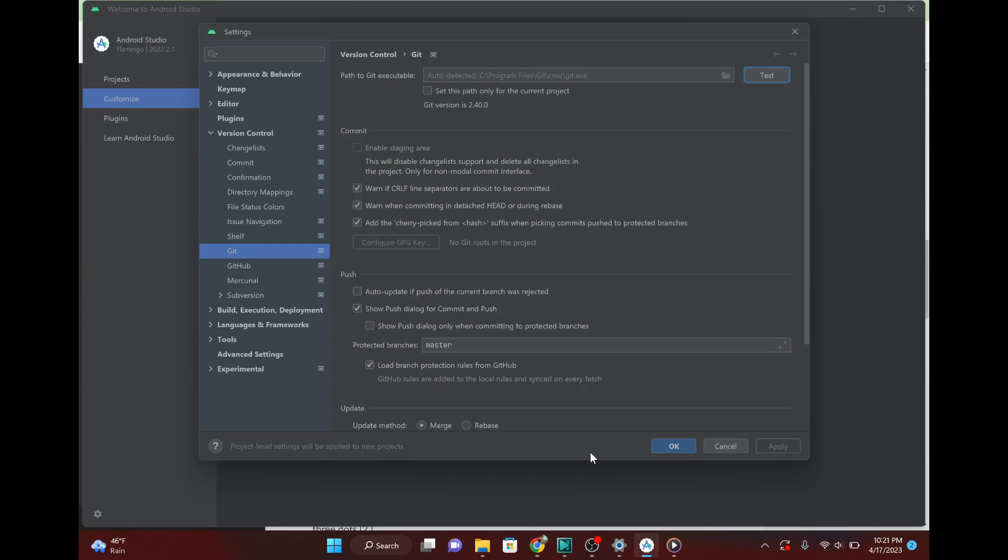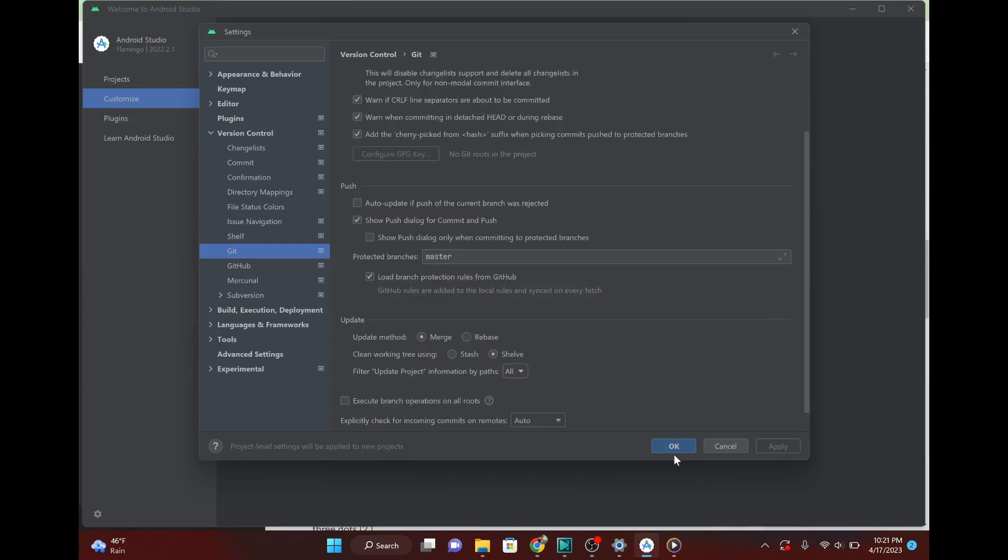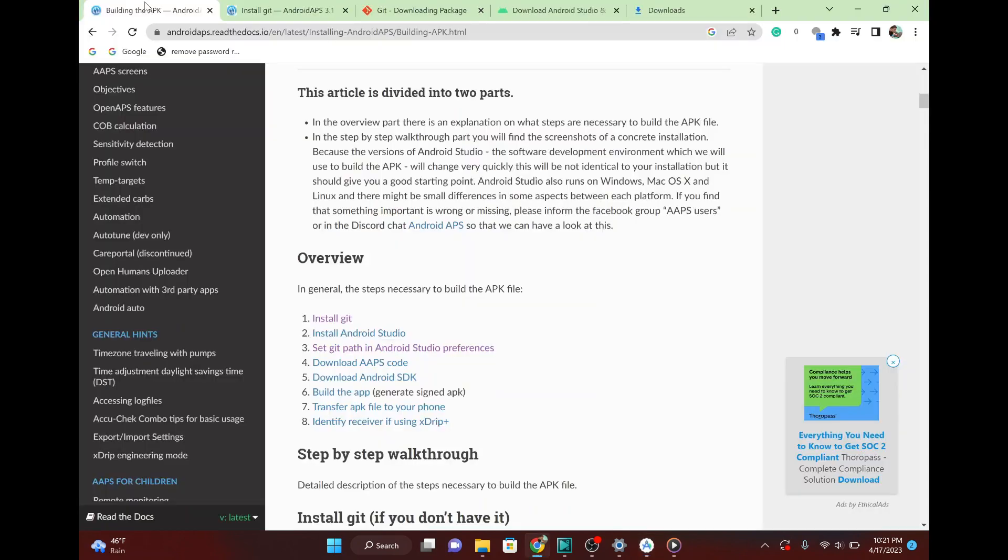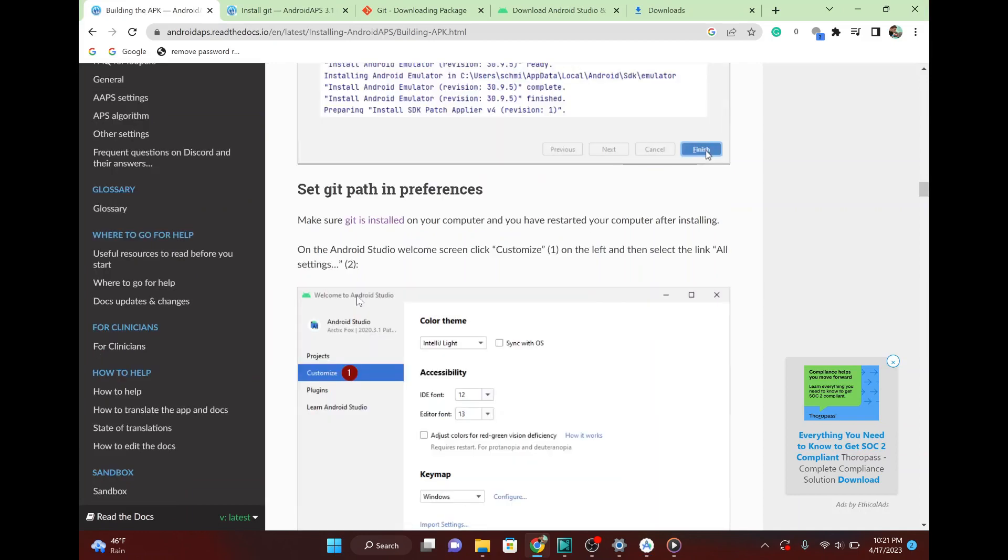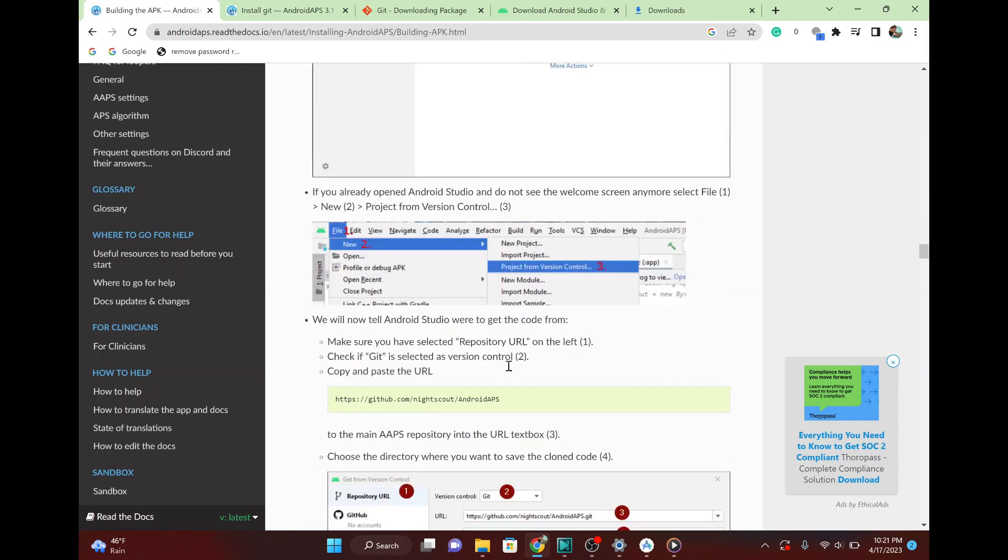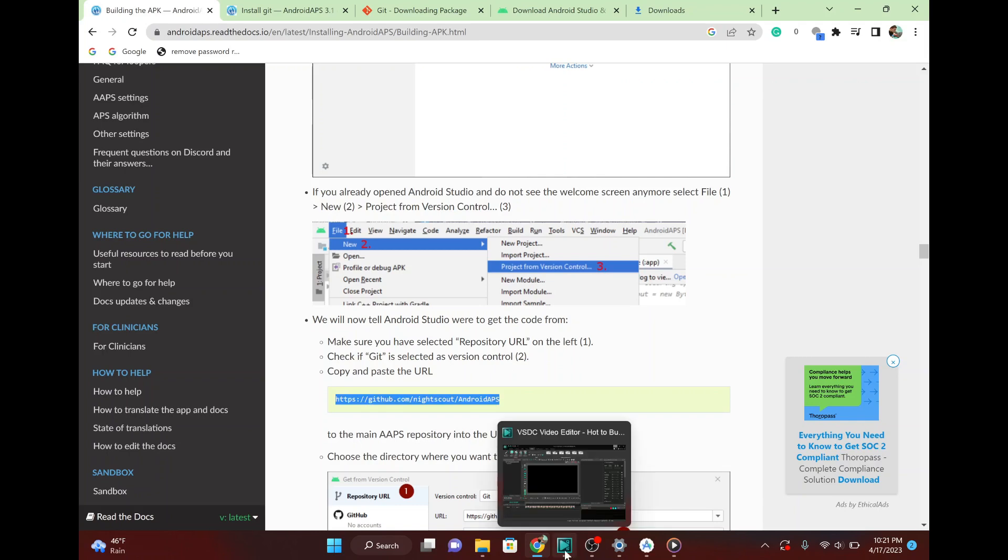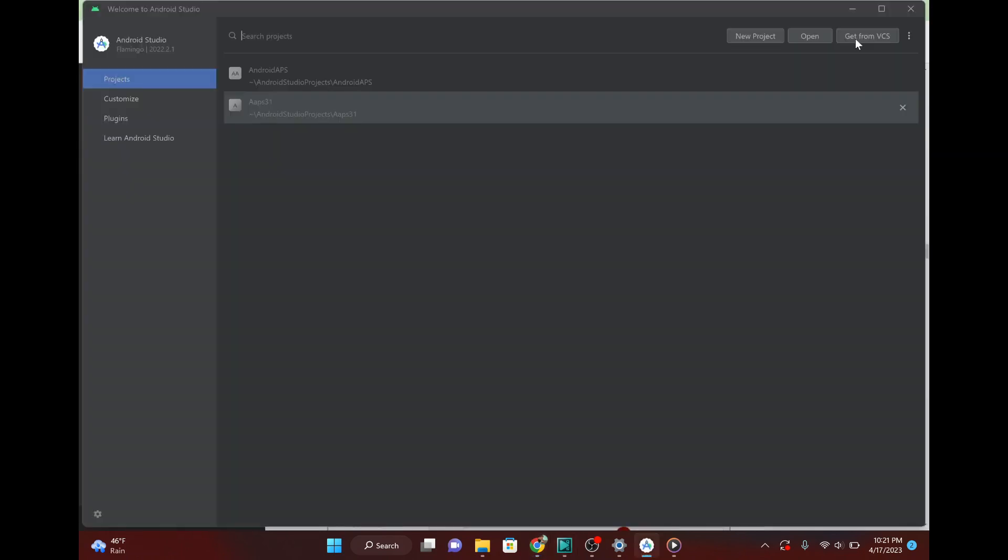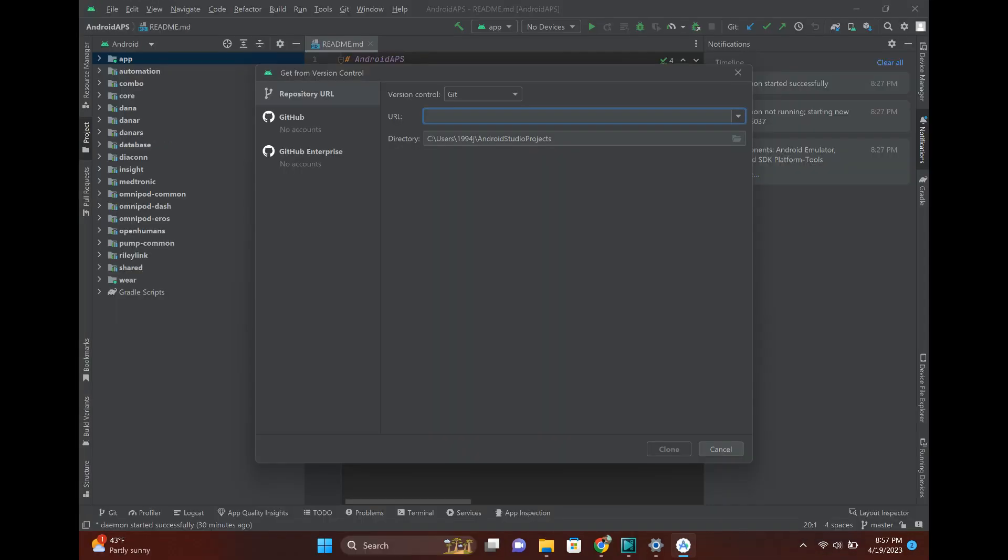So that's all good. Just hit OK there. And then you're going to go back to the building the APK instructions. And the big thing that you need to do here is just get this link. It's github.com slash nightscout slash Android APS. And then what you do in Android Studio. So you get projects and get from VCS, and you're just going to paste that link right there. And you're going to hit clone.